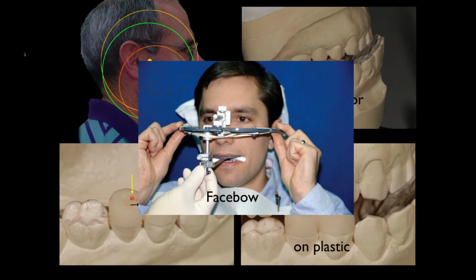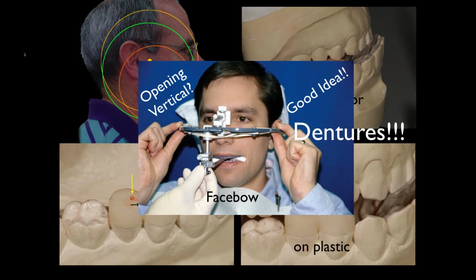Again, another reason to really always go with a face bow, particularly if we're thinking about opening vertical of any type, like dentures or anything like that, or if we're doing a big full arch case, or maybe opposing full arch cases where we know we're going to be opening vertical for convenience because we've got to really try to fit our teeth in there and design them in the best way. We need to have the ability to open vertical if necessary.